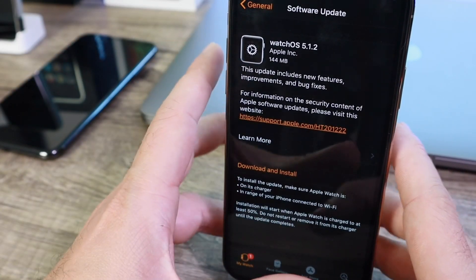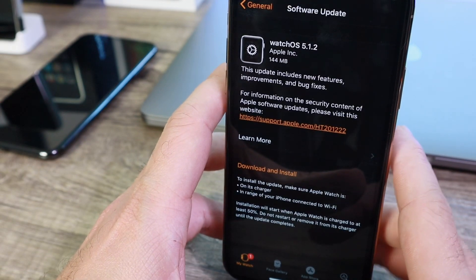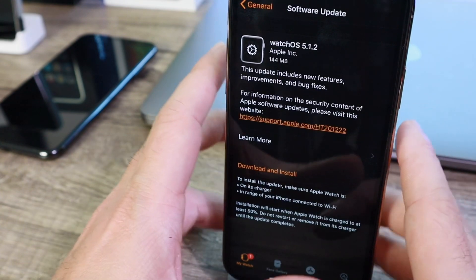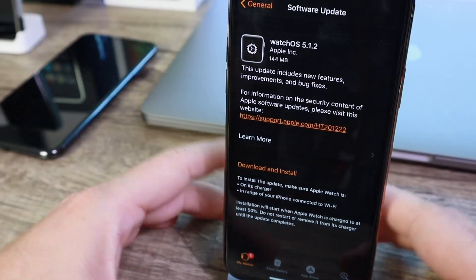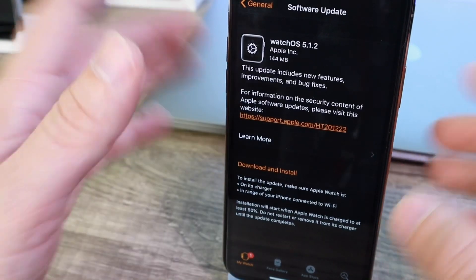There are a few new features that came with this software, but one of the most anticipated is the ECG. The electrocardiogram application for Apple Watch has just been deployed with watchOS 5.1.2, and this is a major step forward for the technology and the evolution of Apple Watch. I want to test it for the first time here on camera with you guys.